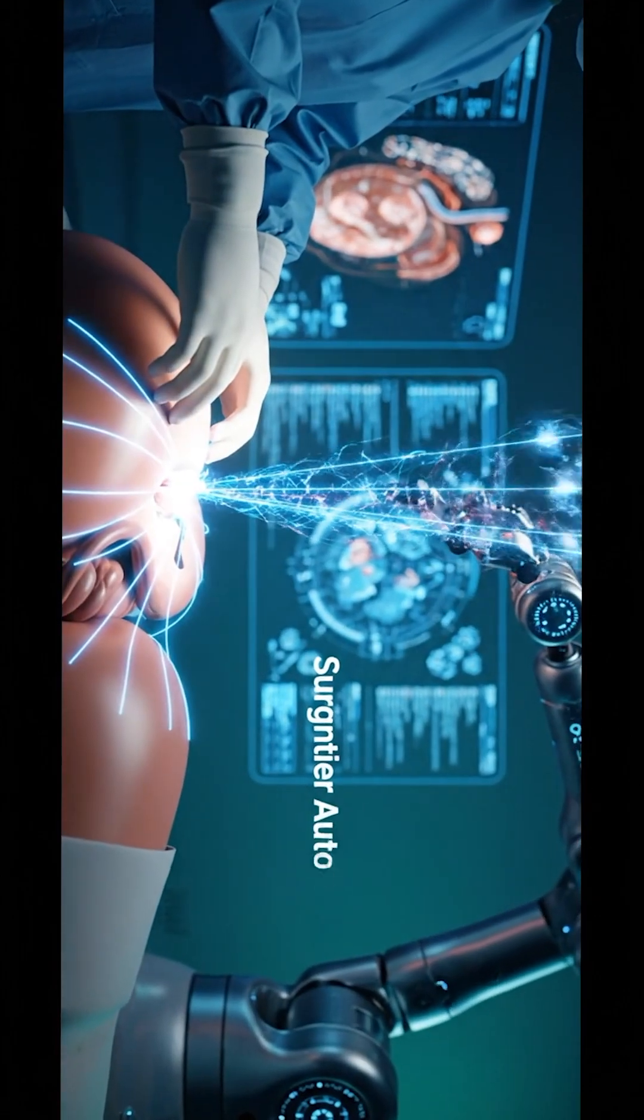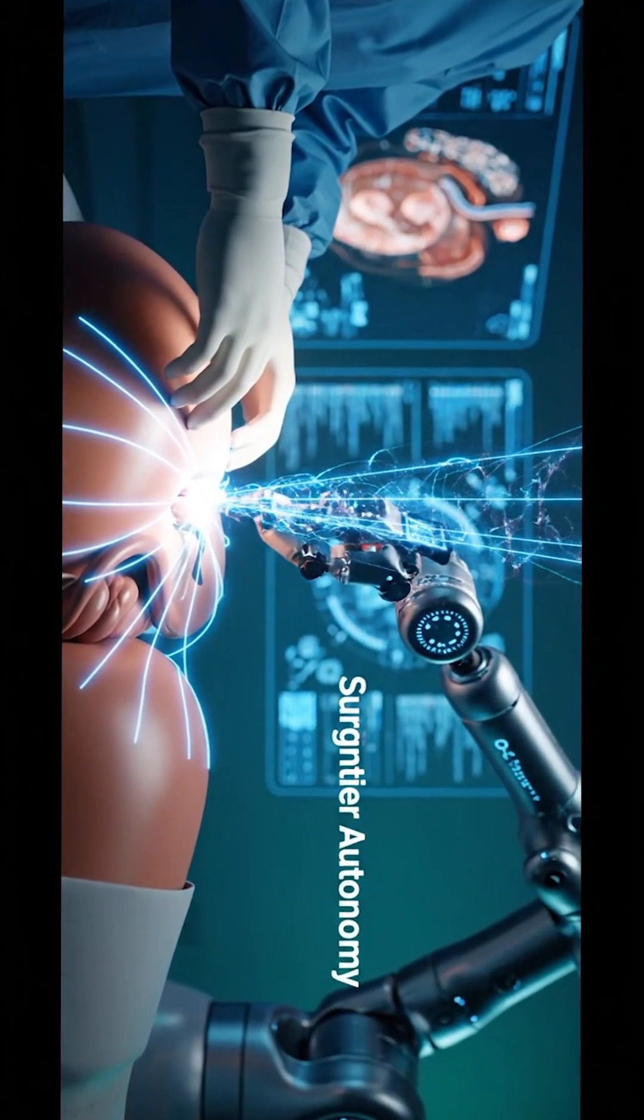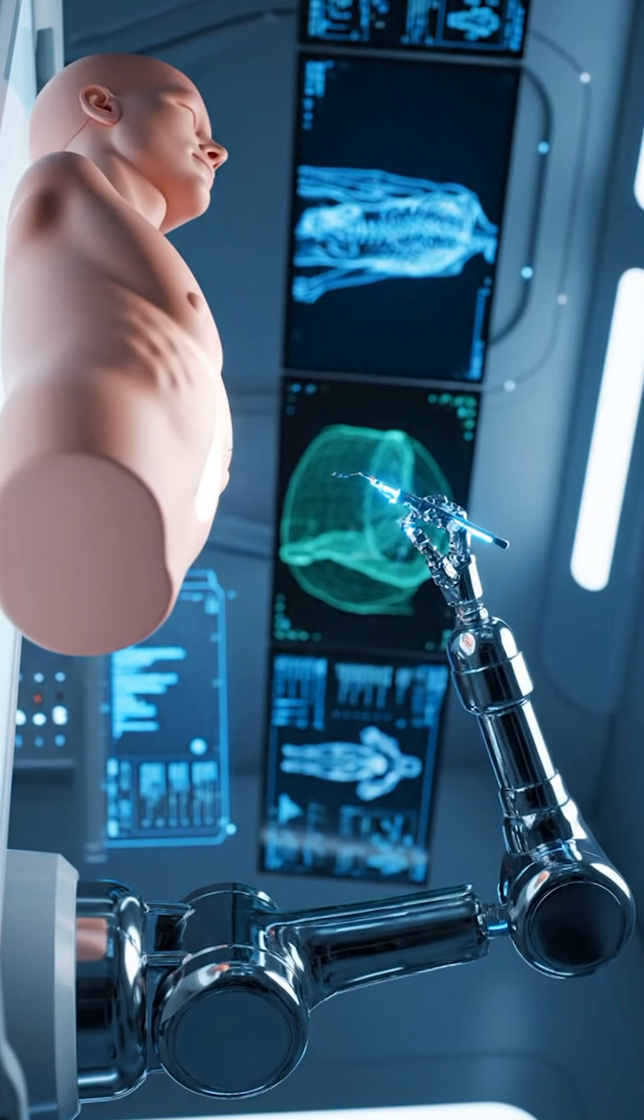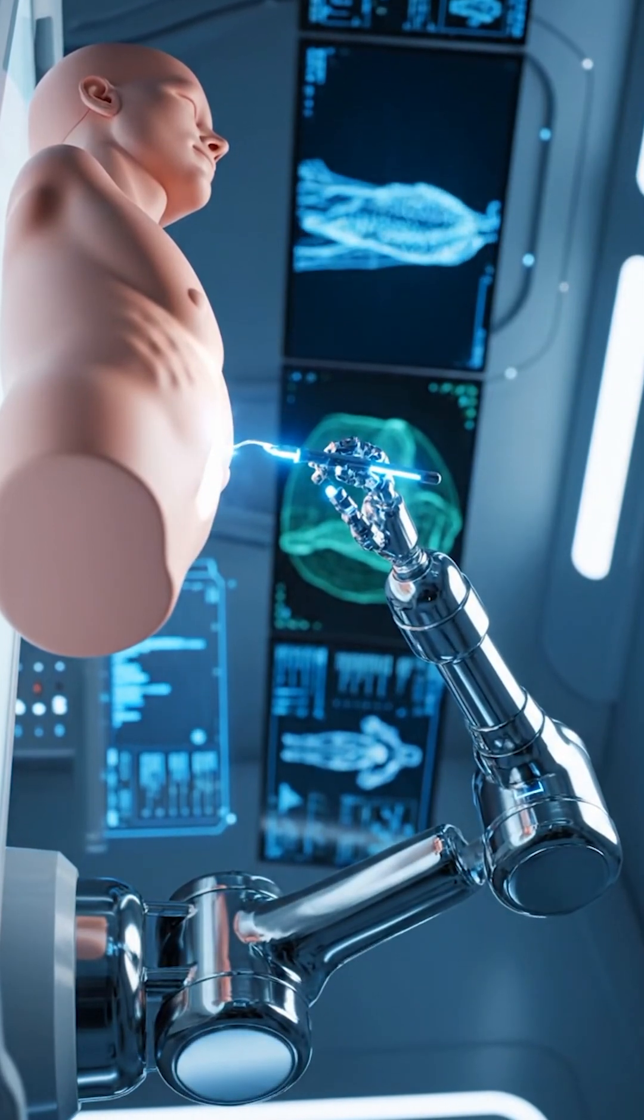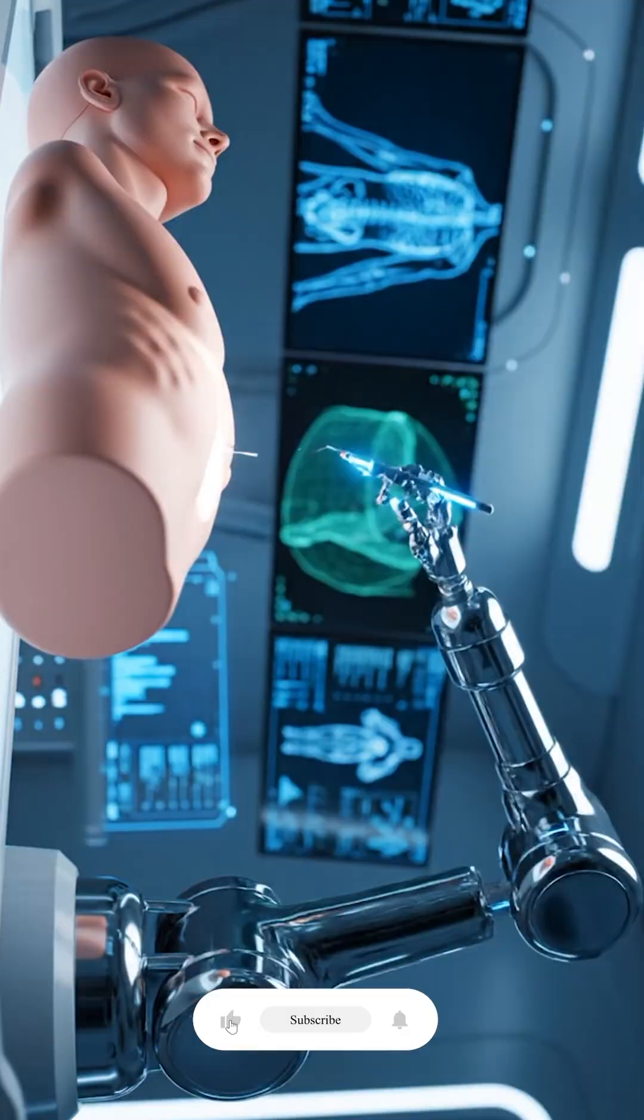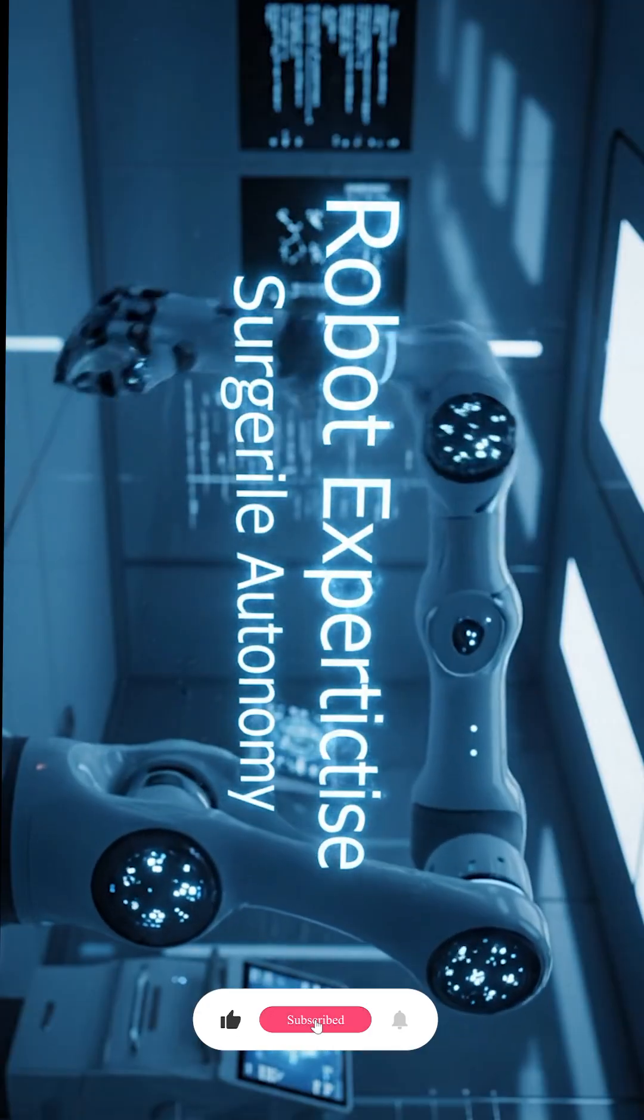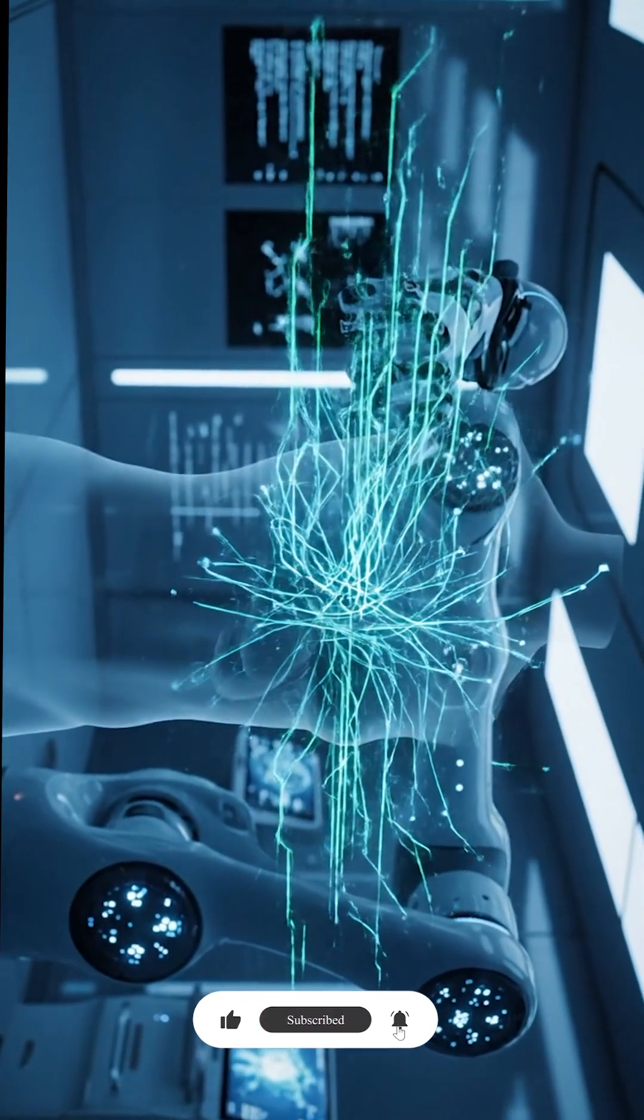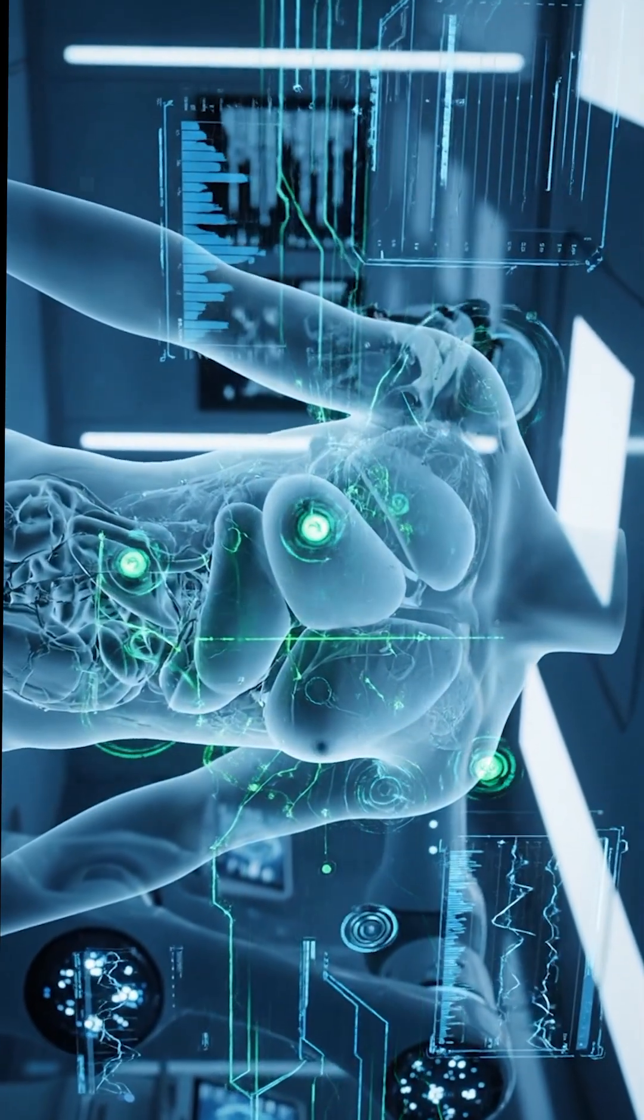Although the procedure took longer than a human surgeon, the robot's expert-level performance represents a major step toward fully autonomous surgical systems capable of understanding what is happening during operations and interacting with it with precise accuracy.